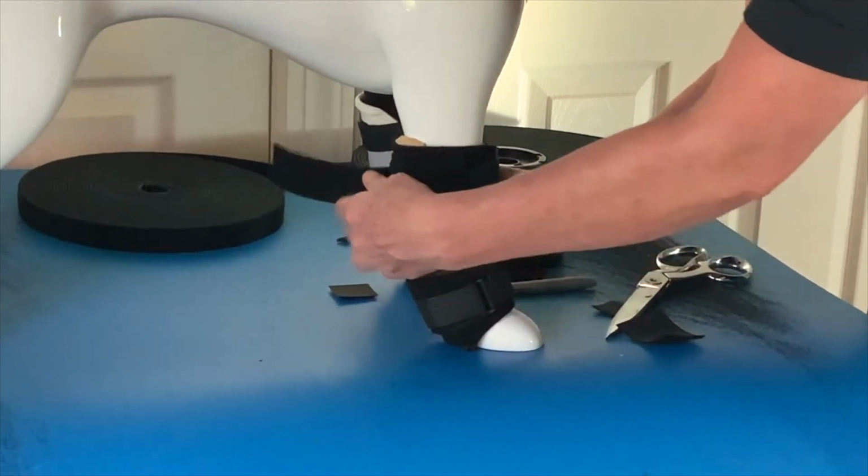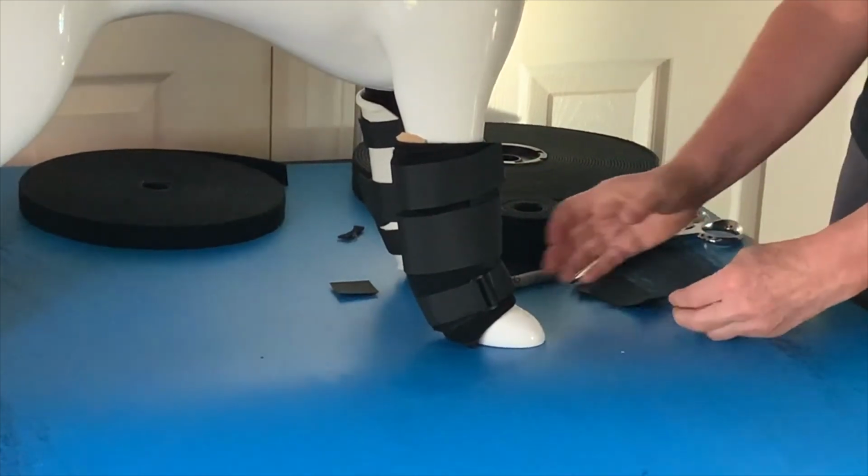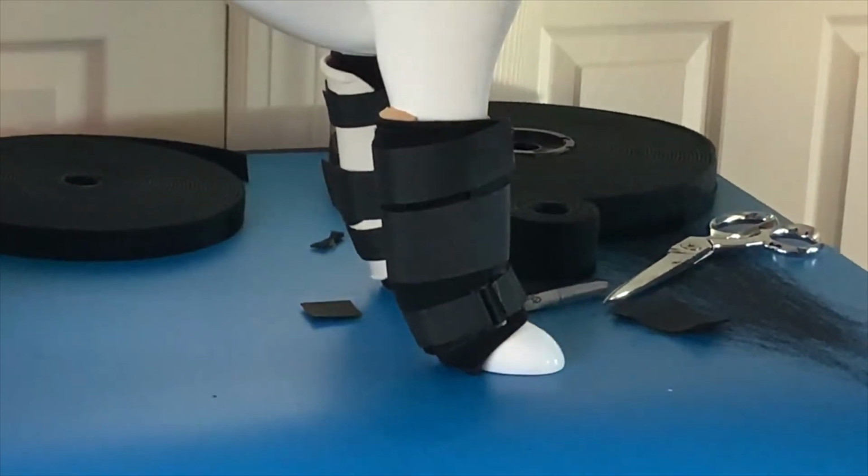You now have a custom-fitted brace that is well shaped to the limb, padded for comfort, and moderately supportive. This brace can also be splinted over with thermoplastic.